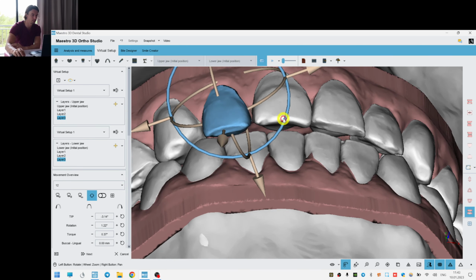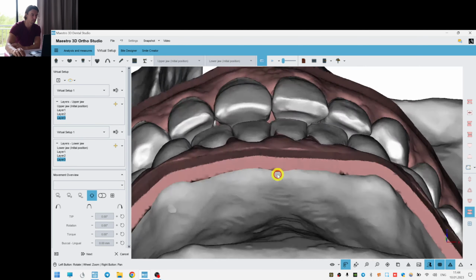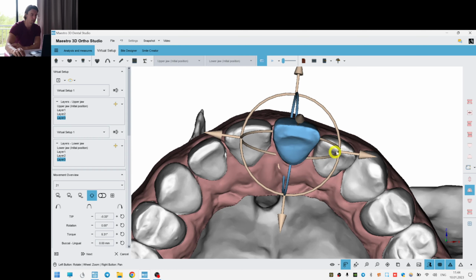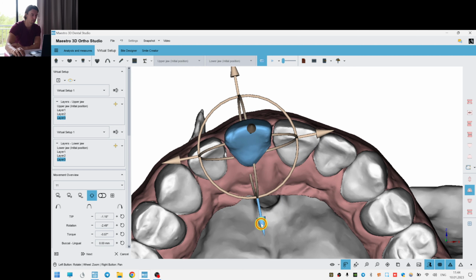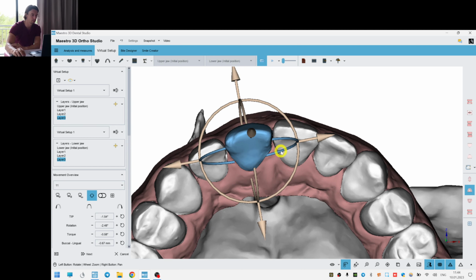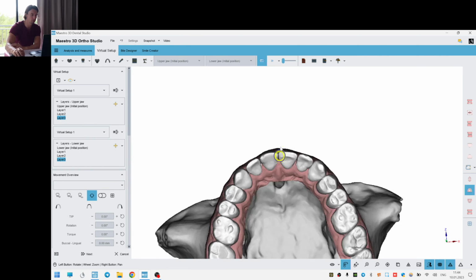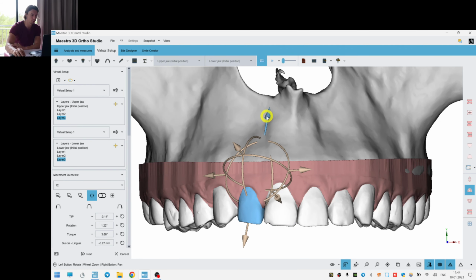Okay, let's distribute the space, reduce the sagittal gap. For the incisors, I think we can improve some torque. At least we can try. So when we combine the pure translational palatal movements of the incisors with some intrusion, we usually don't need the power ridges. This is what the studies say.